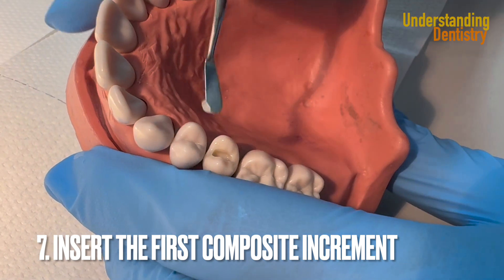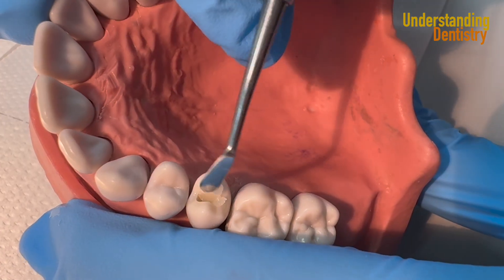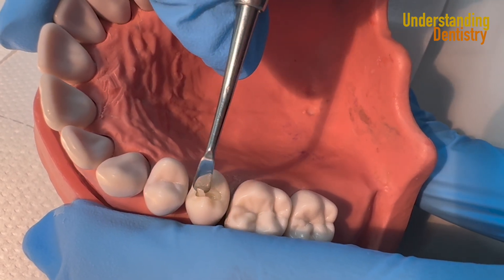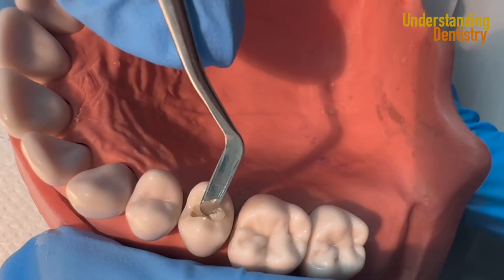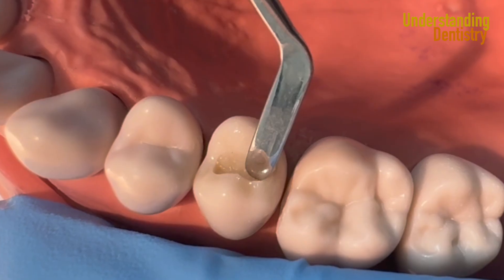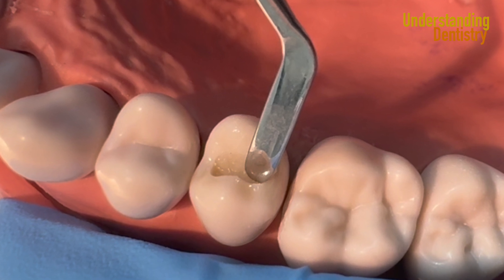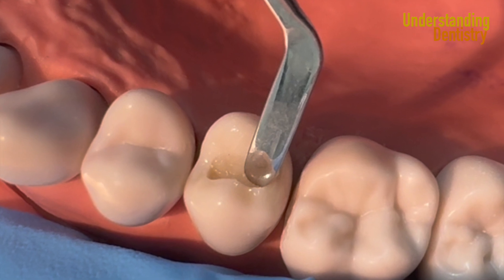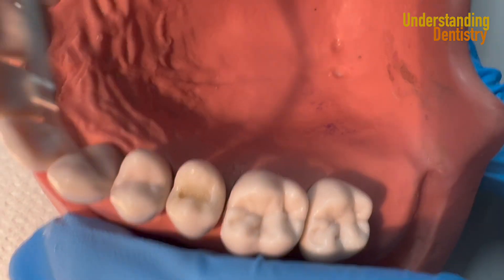We are going to use this composite resin from Ultradent as well — the universal one. We are packing the composite resin into the cavity for the first increment. As you pack, make your instrument parallel to the surfaces of the tooth, the cusp and everything, to make sure you are following the anatomy.